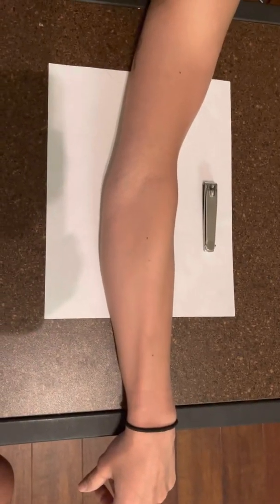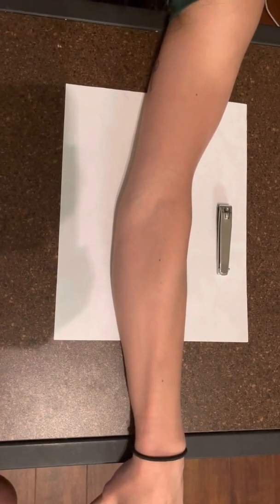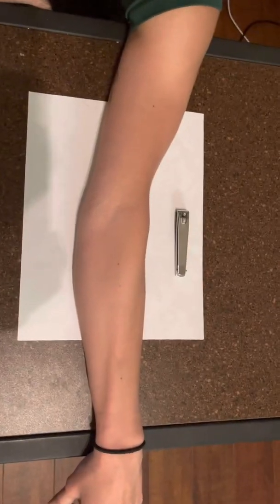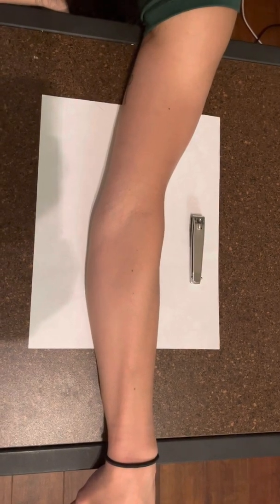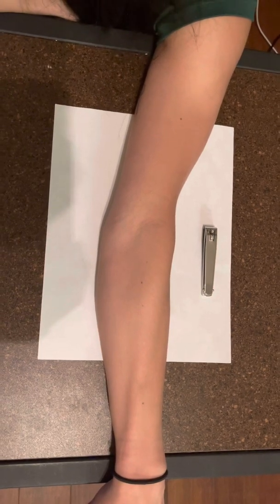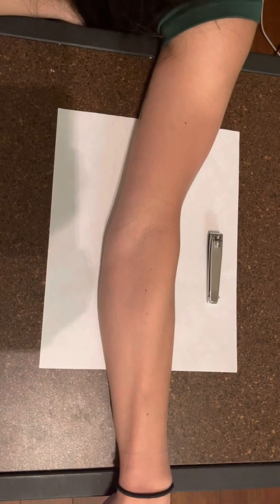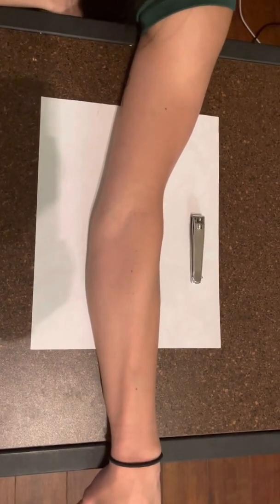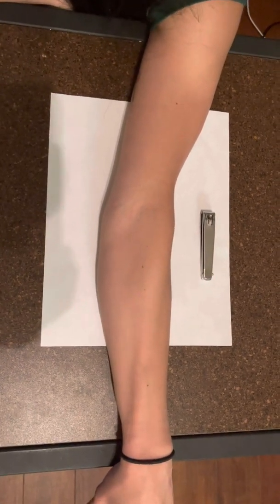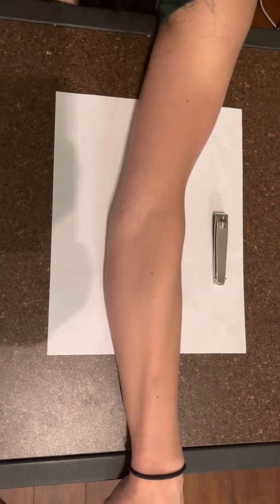For the medial oblique elbow, the arm is extended and the palm supinated, then pronate the hand and center the elbow joint to the center of the field. A line through the humeral epicondyles will form a 45-degree angle with the field plane. The central ray is directed perpendicular to the center of the elbow joint through the center of the film space. The anatomy demonstrated is an internal oblique projection of the elbow joint, distal humerus, and proximal forearm. The coronoid process of the ulna is well demonstrated.